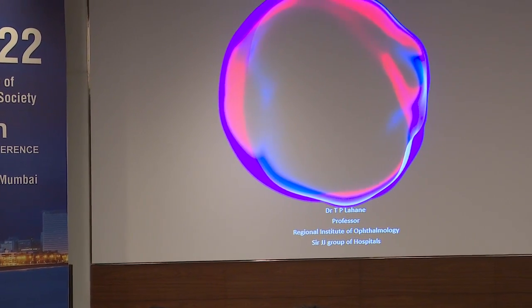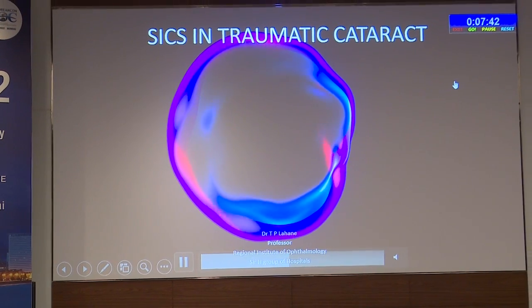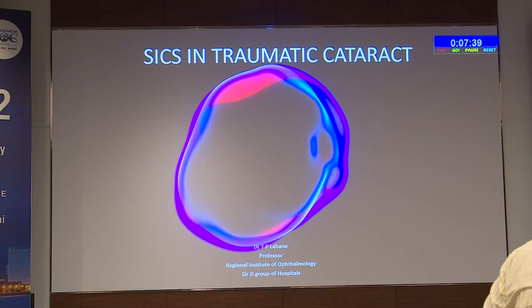It is not going forward. Okay, now it is going.